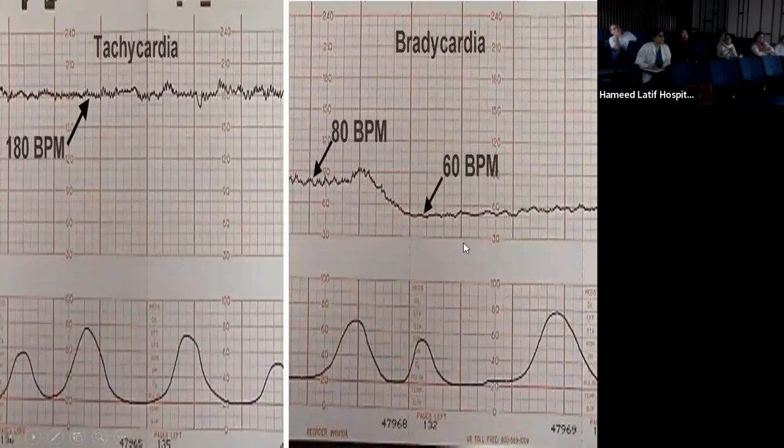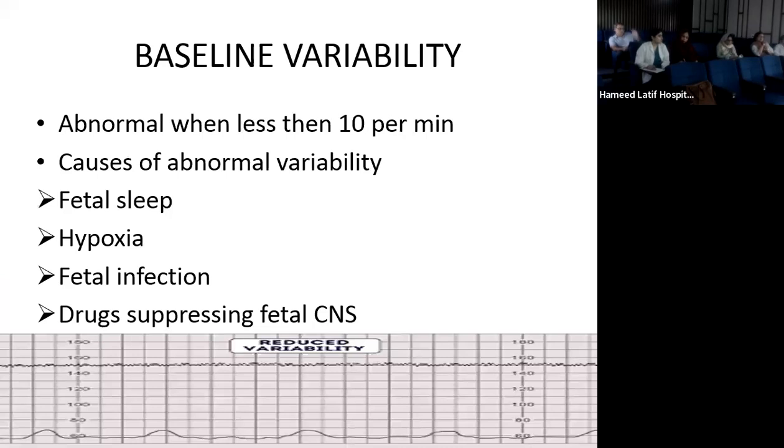So you would term it as that same thing happens with the bradycardia. If it's more than 2 minutes, less than 10 minutes, that's called a prolonged decel. If it's more than 10 minutes, then the baseline is shifted. Then you better do something. So that's important to realize.